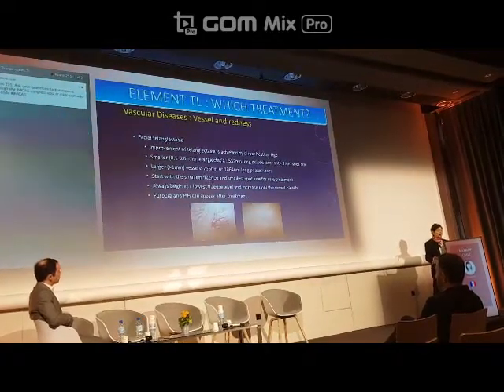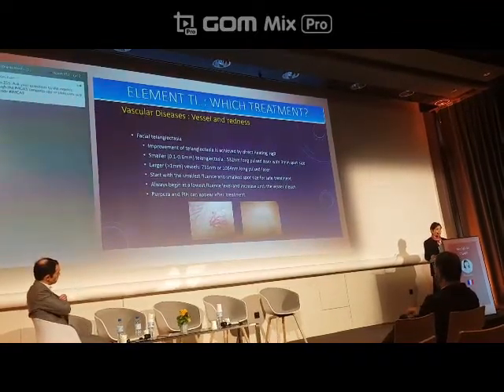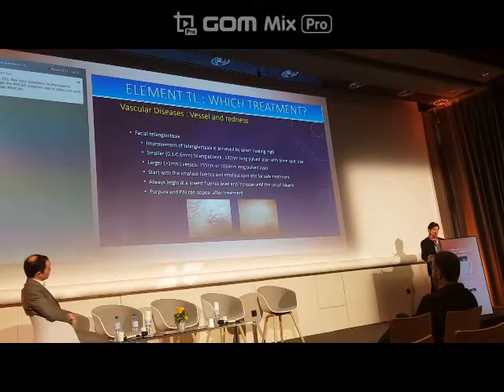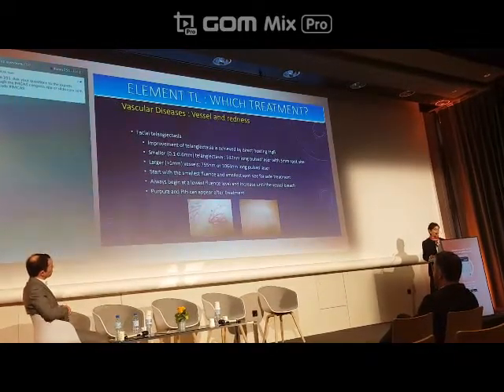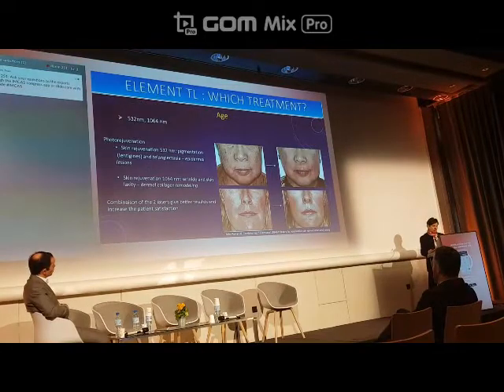Start with the smallest fluence and smallest spot size for safe treatment. Always begin at the lowest fluence level and increase until the vessel bleaches. Purpura and PIH can appear after treatment. You have an example of telangiectasia.